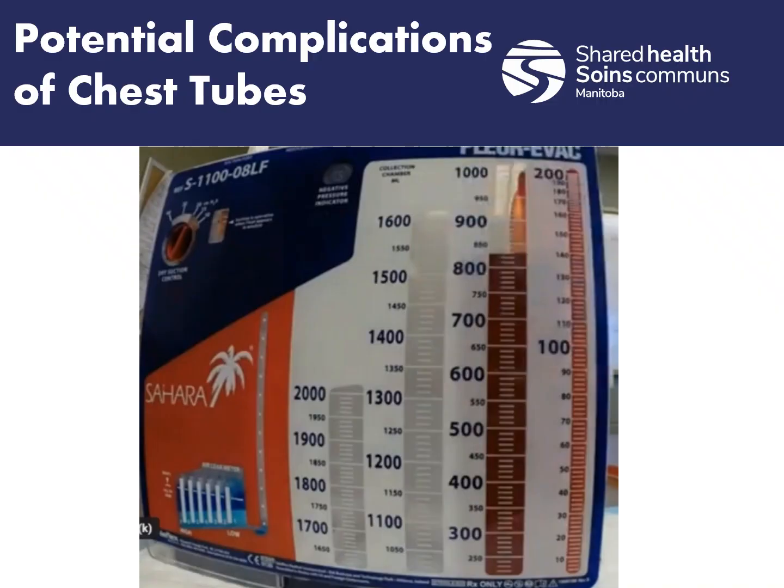So if all of a sudden we're transporting and we see a sudden increase in bright red drainage, such as you see here, so this is pretty fast. If all of a sudden you start seeing blood coming out of your patient, such as this, easily anything more than 200 mLs an hour may indicate vascular injury that requires surgical repair.